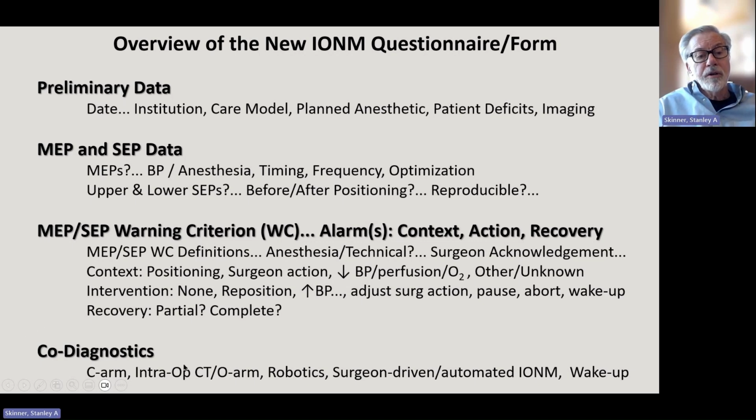A co-diagnostic section is also listed so that we may know whether C-arm, intraop CT, robotics, or other surgeon-driven automated neuromonitoring devices are used, and whether or not a wake-up test has been performed either as part of an alarm or electively sometime during the case.